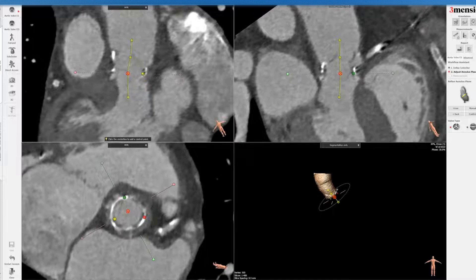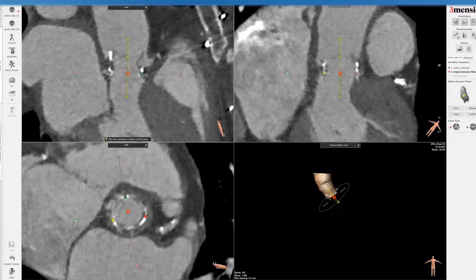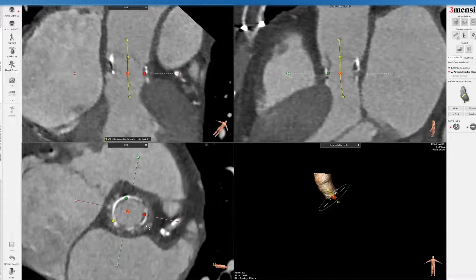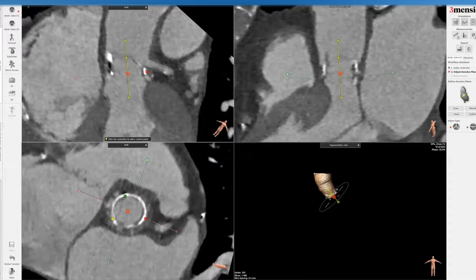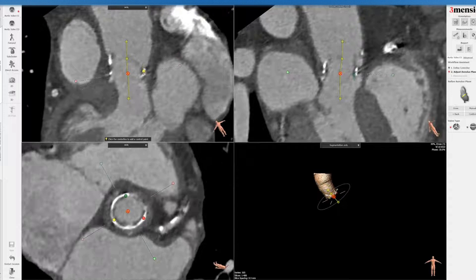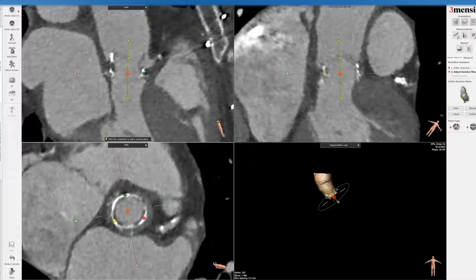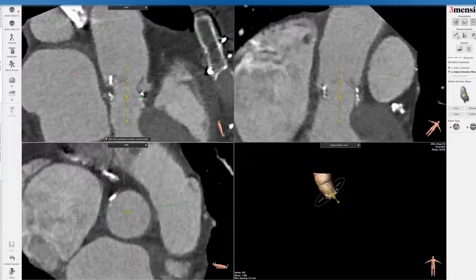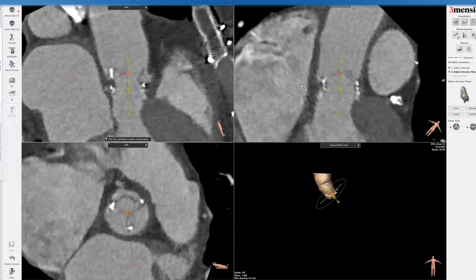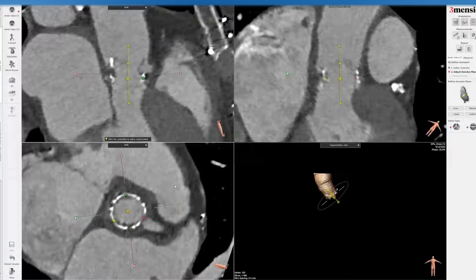You want to be at the bottom of the frame. I'm going to go up and down to see where it is. You want to be relatively symmetric here — you can see this one is a little bit off. With a surgical valve, the commissures are typically about 120 degrees apart. You can see this is pretty good. It's sometimes not easy to make it perfect, but this is the coaxial alignment to the surgical valve that I was talking about.